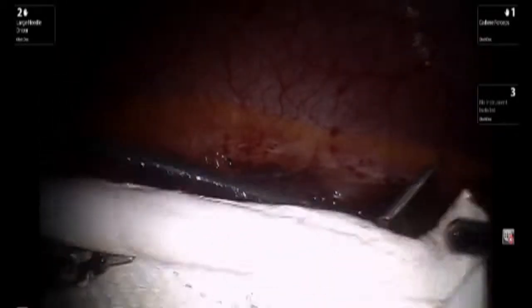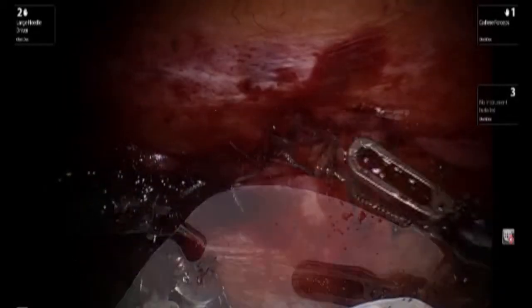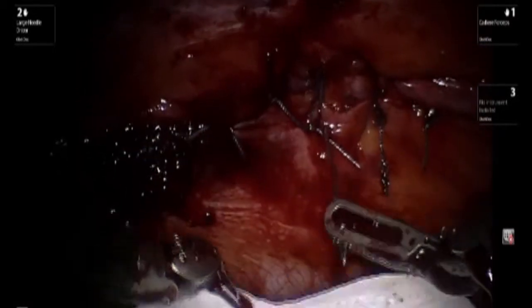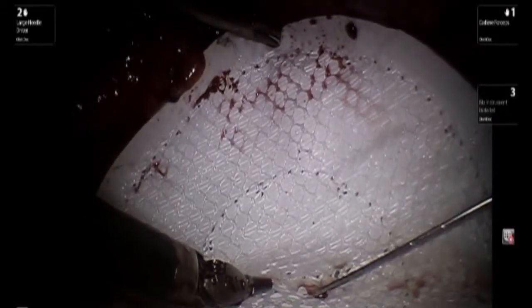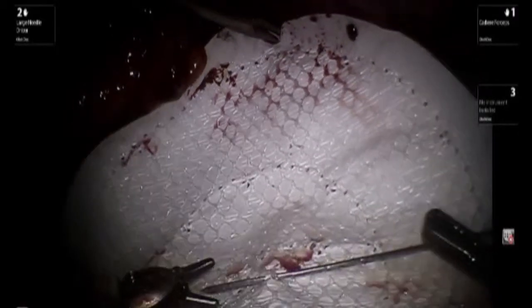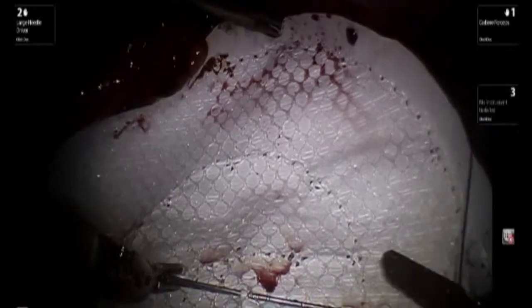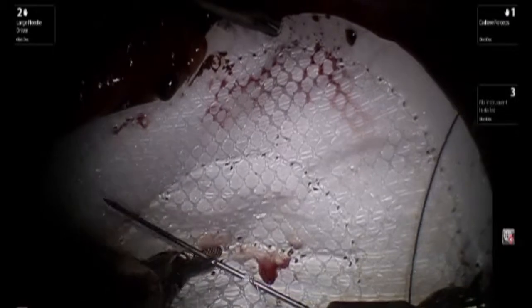A mesh is introduced into the abdominal cavity. It is a circular piece of mesh. At the mid portion of the hernia defect, a straight Keith needle is introduced. This will then be placed through the mid portion of the mesh and back through the abdominal wall. This will allow the mesh to be tethered at its mid portion so that it doesn't move around while suturing the mesh edges to the abdominal wall.